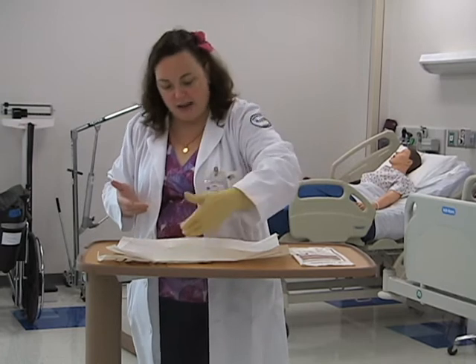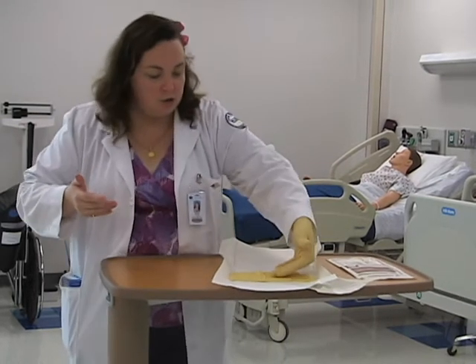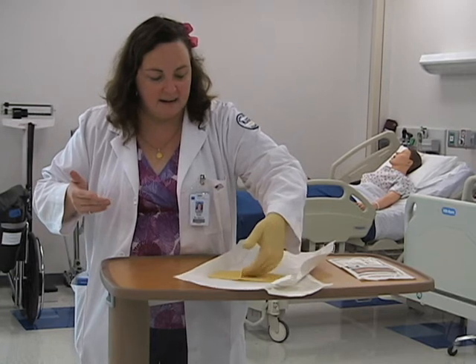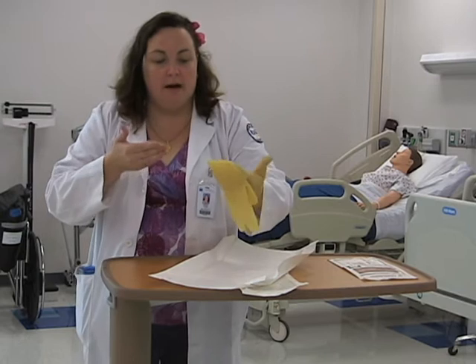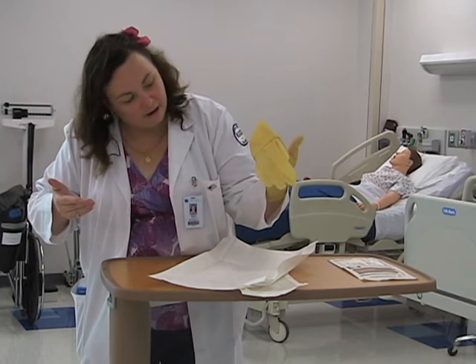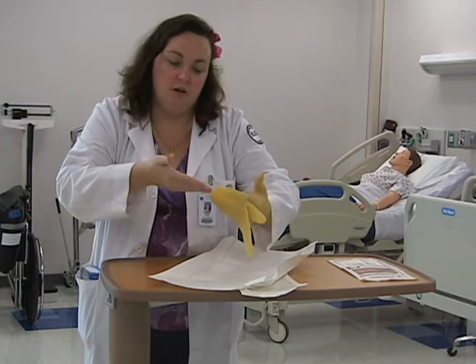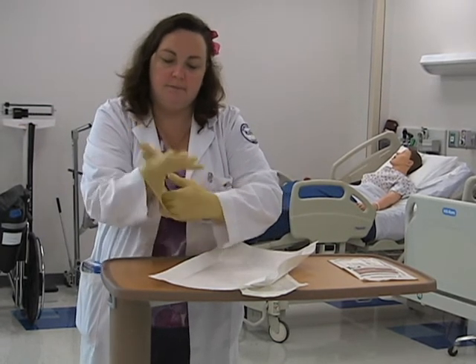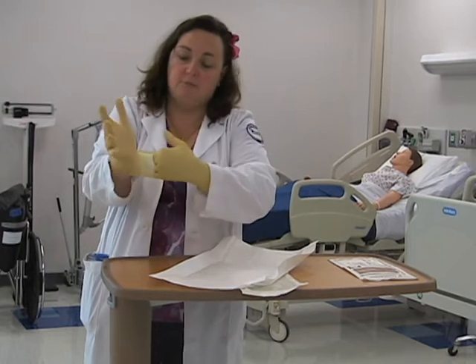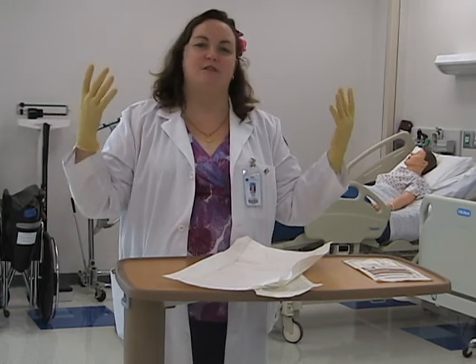Using your sterile hand, you're going to lift — I'm going to turn a little bit so that you can see. Put your hand inside the cuff. Now if you look here, there are my fingers, there's my thumb. Using your non-dominant hand, you put your hand in. See how I'm pulling with my hand still in the cuff. Now I have two sterile hands and am ready to work.